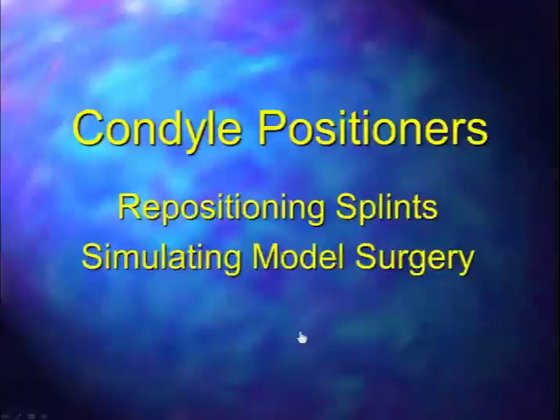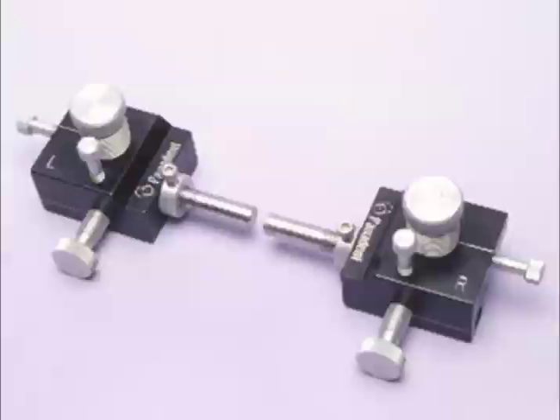We also have condyle positioners, which are used for making repositioning splints or simulating model surgery. They go in place of the motion analogs, and they have little screws on the top and in the back here. And one full rotation of the screw is 1 millimeter. There's actually a little line on the screw in the housing here so you can measure the rotation of the screw. As we screw the top screw down, it would be like impacting the maxilla. Screwing the back screw forward would be like an advancement of the mandible. The combination of the two would be like an auto rotation of the mandible.